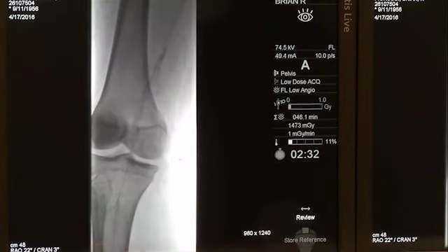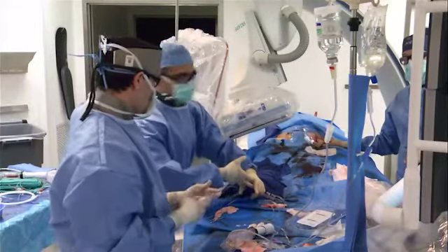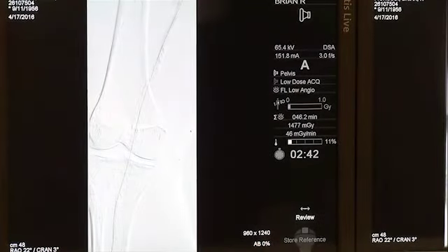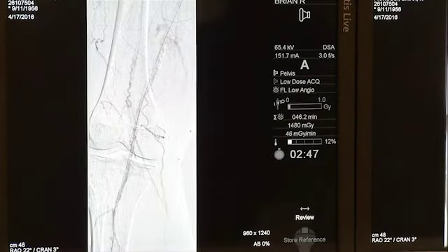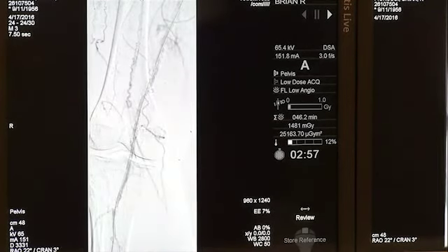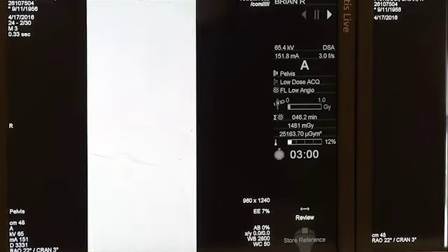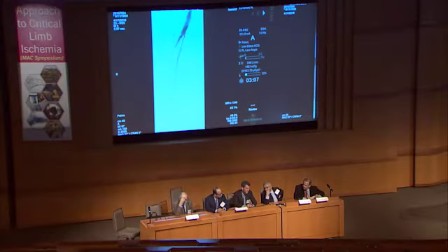Can I get that 6 by, you want to put 6 or 6.5 for the Supera? What if we put on the other side? It actually doesn't look that bad, to be honest. What do you think, Dr. Walker? I think it looks very good. Still, my bias in this kind of a case would be to stent this entire area. Yes. I'm not a big fan of, in general, full metal jacket, but I think this is an area where that would be my approach.